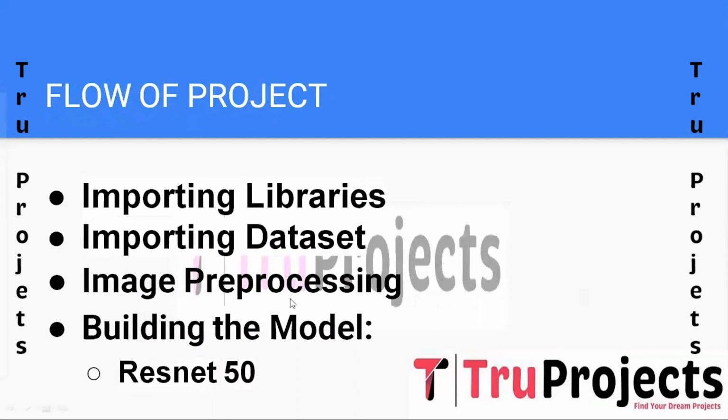And the third step is image pre-processing. Before feeding the MRI images into the model, pre-processing steps are applied to enhance the data quality and prepare it for efficient training. This includes resizing the image to a consistent resolution, normalizing to ensure the pixel values are within a certain range, and data augmentation techniques to increase the dataset size and improve the model generalization.